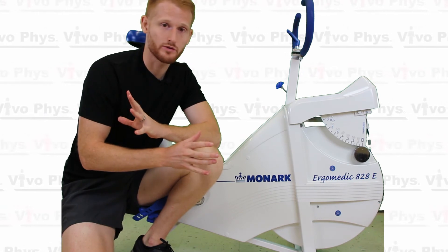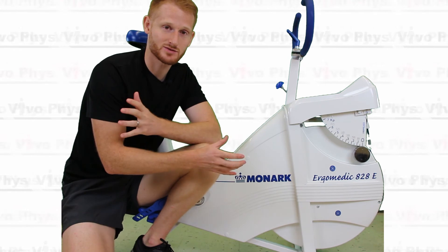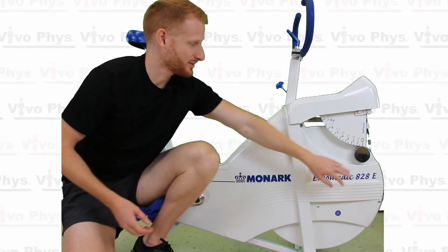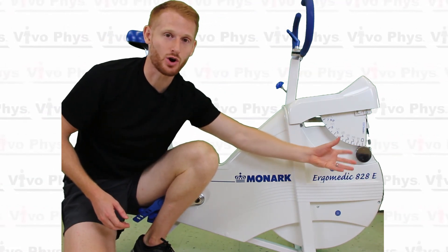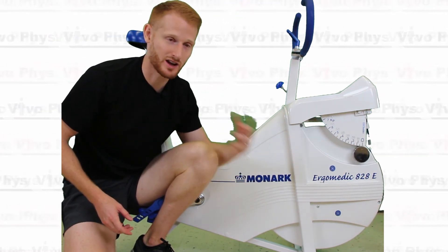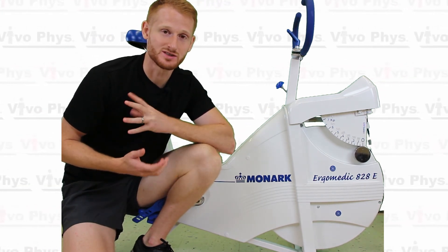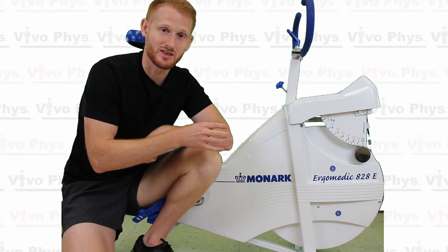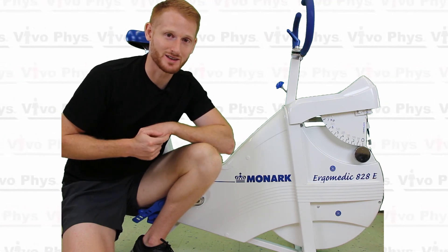That was a quick overview of how to use one of these Monarch bikes. They're really great for doing a lot of different exercise tests. The reason why most people like these bikes is they're super durable, and because it uses this pendulum style weight, the calibration is very hard to mess up — it comes calibrated and it tends to stay within its normal calibration. If you have any questions, go ahead and put those in the comments below and I'll try to answer them as quickly as I can. Otherwise, please come back and watch another video. Thanks.